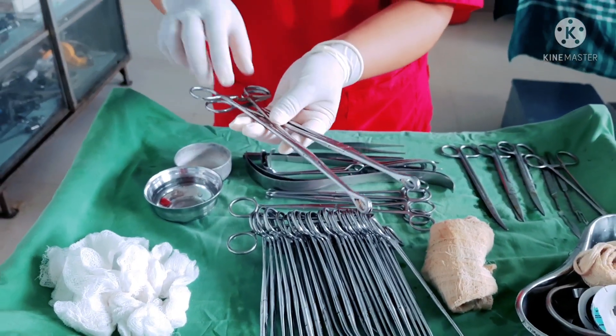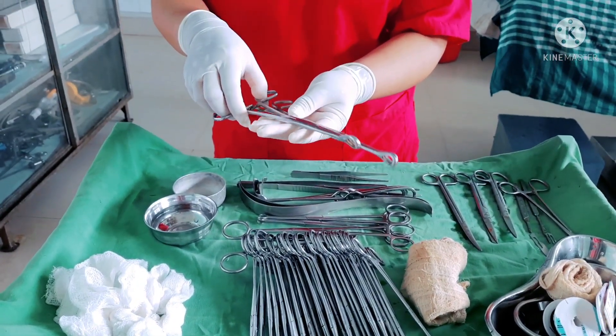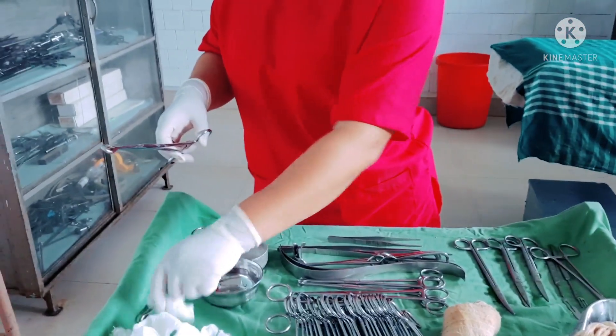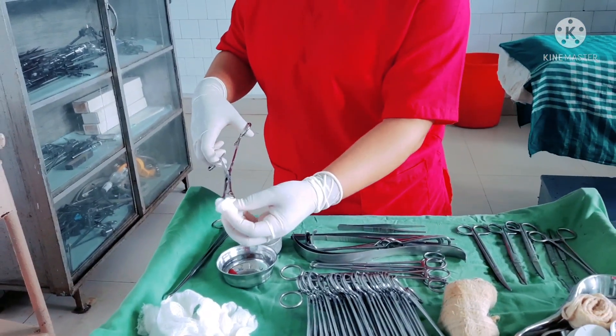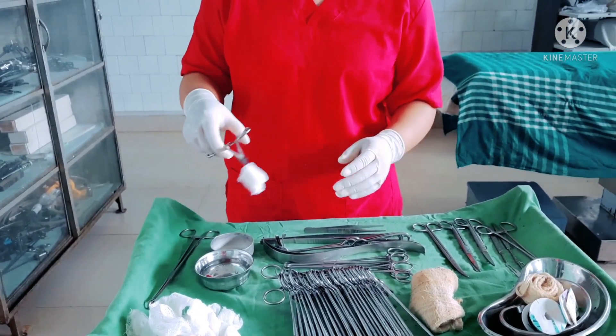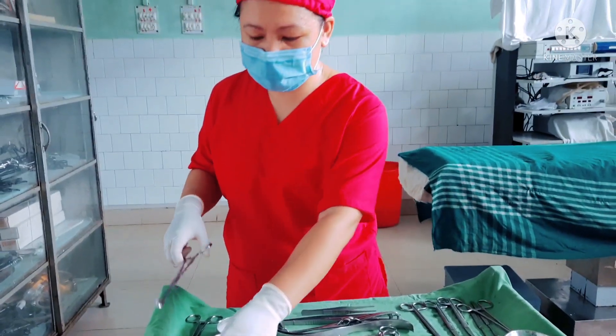First of all we have these two sponge holding forceps. These sponge holding forceps are used to hold gauze pieces and to soak in betadine or spirit, and to clean the surface area of the patient before the incision.